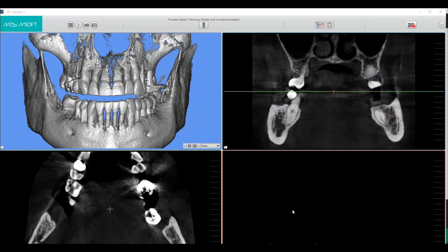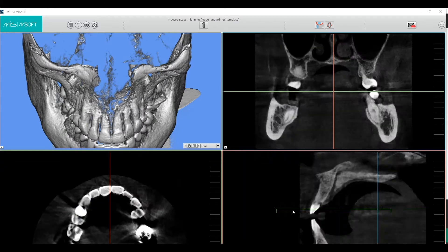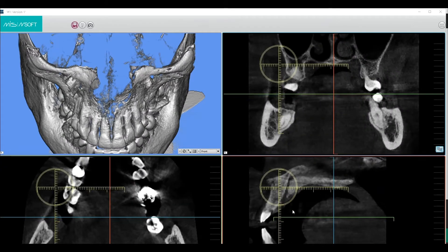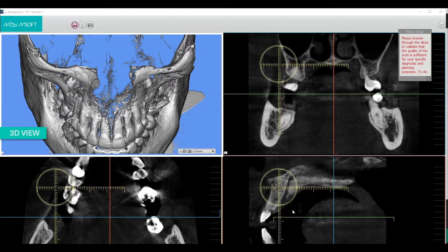Once the upload is complete, you will see this screen. The screen is divided into four viewing windows. In the upper left, you can see the 3D view.